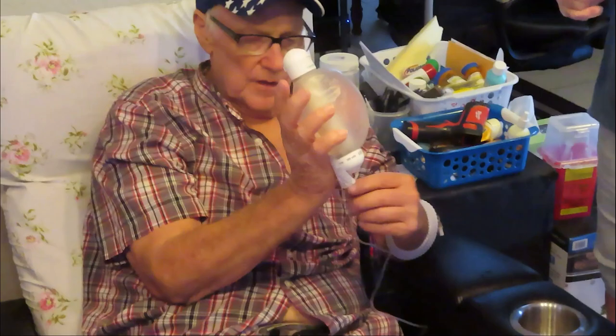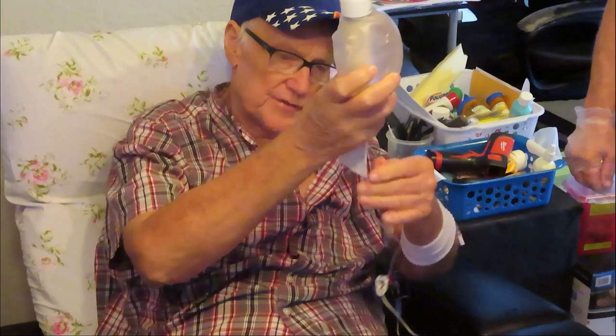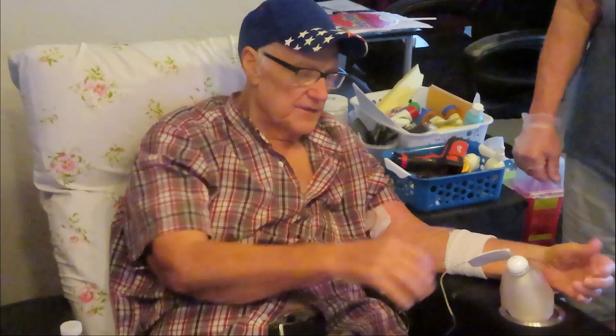Now the only thing we gotta do is open the valve here. Just open the valve there. Then I like to pull the hose out and then just rub the hose because it puts a little kink in it. This is under pressure. So we're done. This is all you do, and just set the ball somewhere and don't fall. And that's it of this.